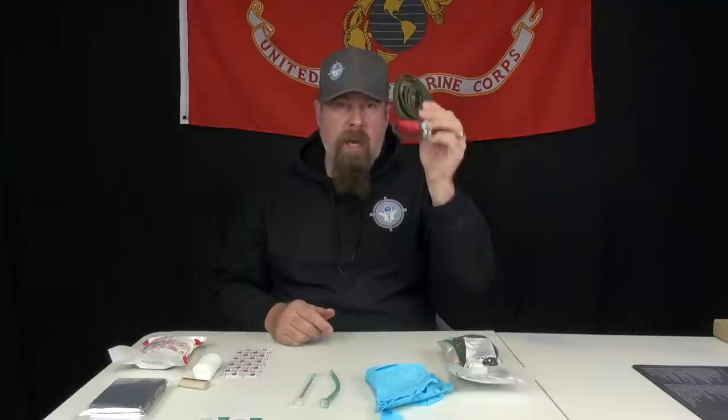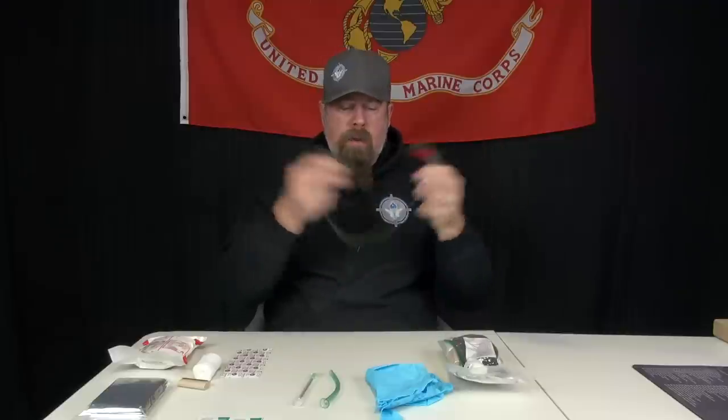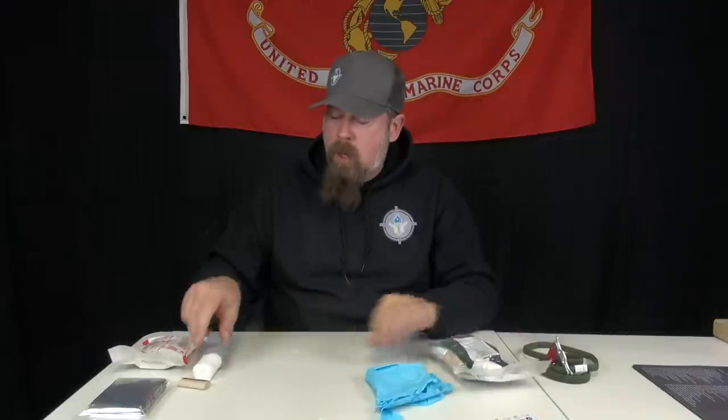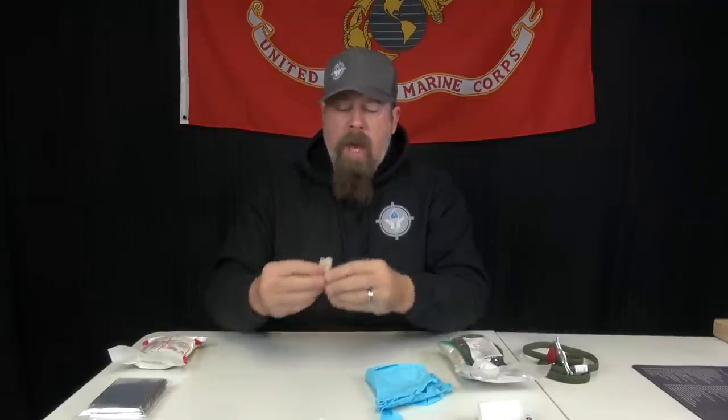This kit in particular — the combat lifesaver kit — it's the largest, most inclusive kit we have. We start out with a RAT's tourniquet, the olive drab, the new RAT's olive drab 2.0 version. I've got an NPA nasopharyngeal airway, a 14-gauge stainless steel chest decomp needle, and an adhesive bandage for things that don't require tourniquets but you should still cover the wound. A couple of alcohol wipes to clean the wound before putting the bandage on, and a mini gauze.